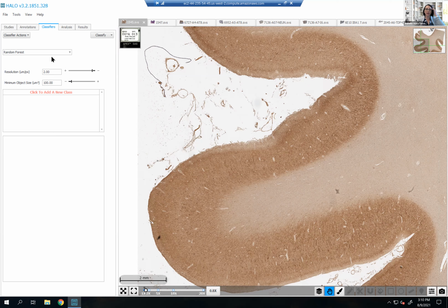However, you can use it only for stains or regions of interest that are very distinct from one another. For example, it uses features like the color or the texture of the tissue, so I can separate the regions of interest, for example, in this case, between gray matter and white matter. For the sake of this webinar, I'm gonna show you the pre-trained model that I made.